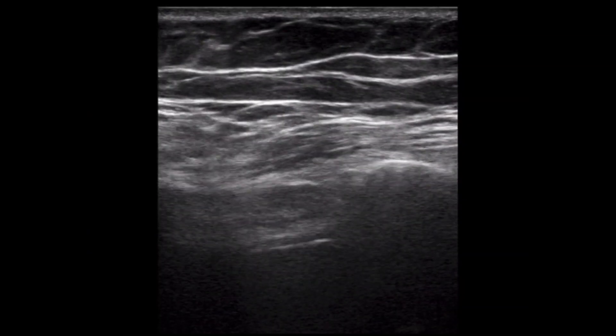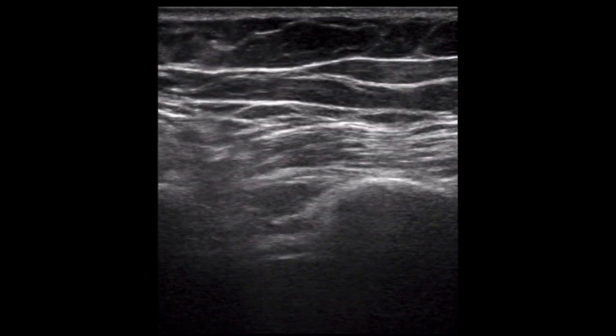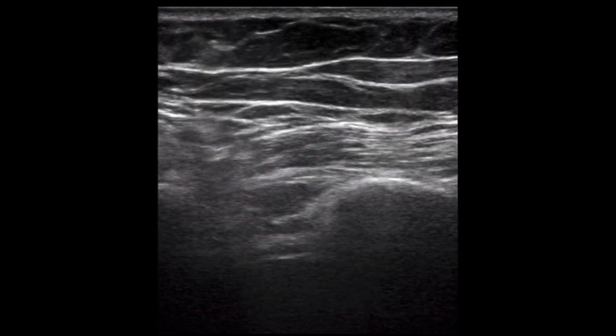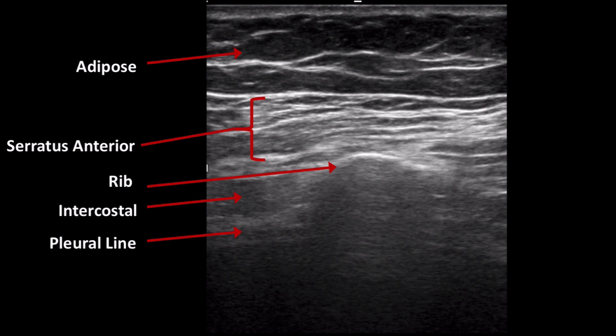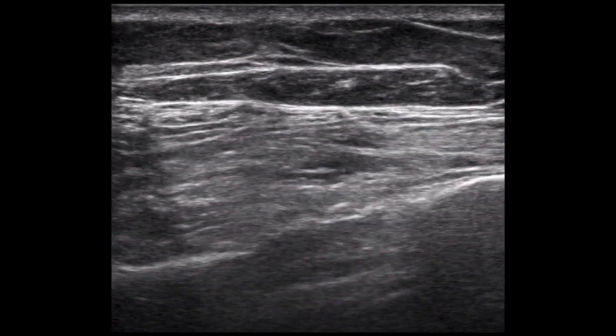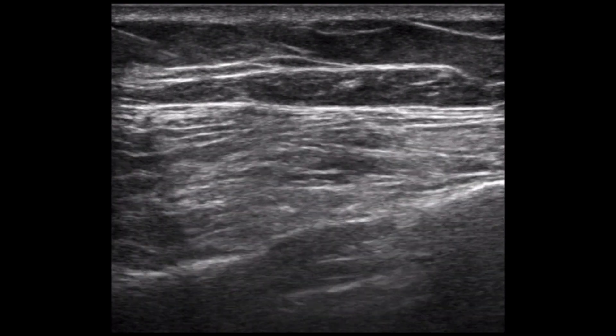This is the actual video of our patient. Take a second to test yourself and attempt to identify the structures we highlighted in our previous examples. Hopefully you were able to correctly identify all the structures — with the most important being the rib and serratus anterior muscle. The plane being targeted is the area just superficial to the serratus anterior muscle body. Now that we know our anatomy, this video shows the actual procedure. Thanks to Dr. Tom Ladaro who assisted in capturing the images.